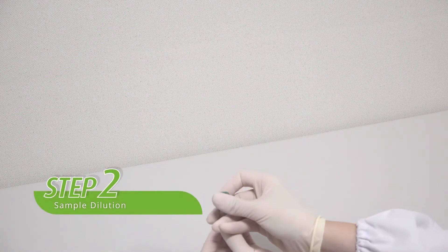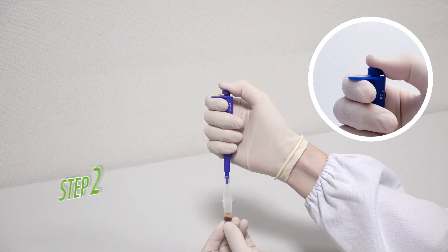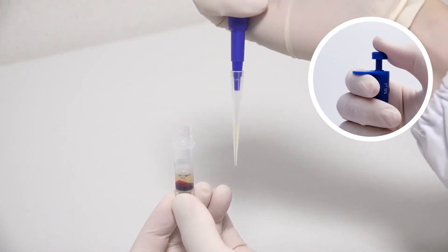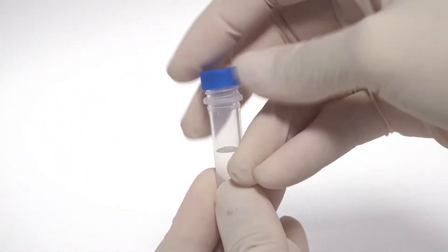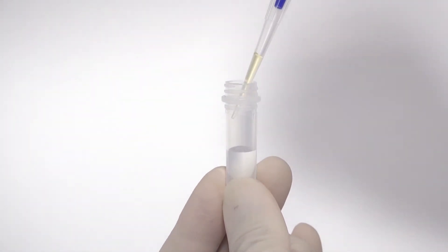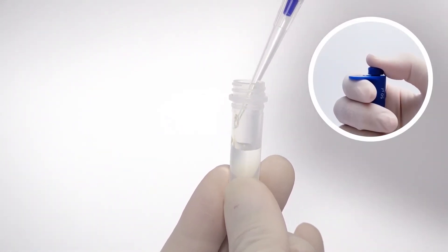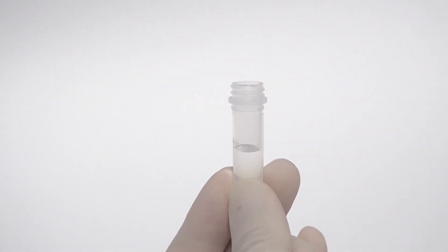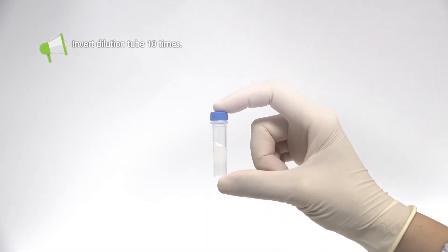Step two: prepare the diluted sample. Use a pipette to draw 50 microliters of sample from the collection tube. Samples should be taken from the clear portion of the centrifuged sample. Before opening the dilution tube, please spin it for several seconds via centrifuge to avoid liquid loss on the cap. Then open the cap of the dilution tube and gently and slowly inject the sample into the dilution tube along the upper side wall, making sure the sample has been pushed out of the tip. Close the cap tightly after injecting the sample, and invert the dilution tube 10 times to thoroughly mix the sample.